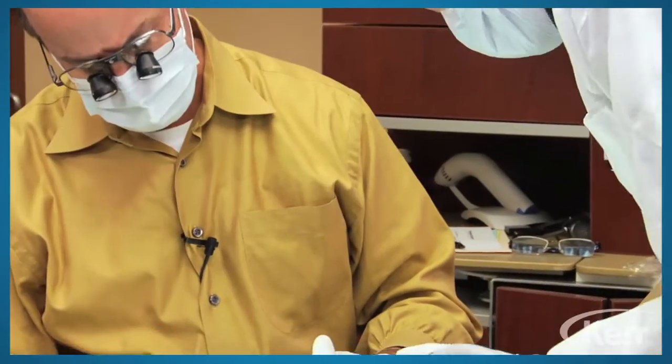So what we'd like to do is just fix this very simple class 4 chip on tooth number 8 on Jessica. Very nice patient here. And it's very small, but sometimes the small ones actually can be difficult. So with that little intro, let me get started.